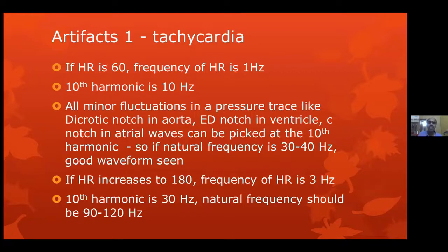When you put a catheter into the left ventricle in a patient who is having an aortic stenosis and induce a ventricular tachycardia, immediately the pressure transducer becomes dysfunctional and it stops recording accurate pressures. Another artifact: calibration method was not completed. Calibration is basically that you need to connect the pressure transducers to your standard pressure.